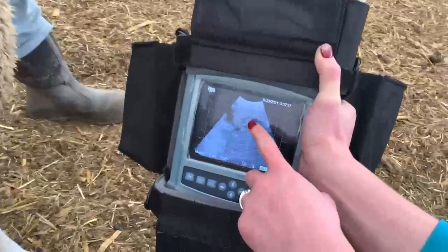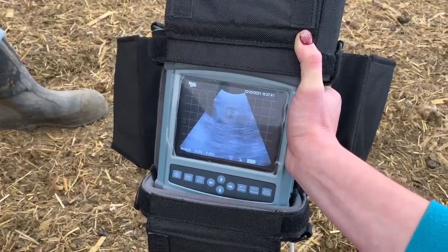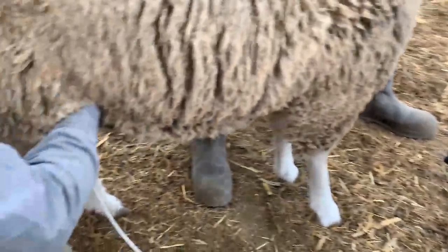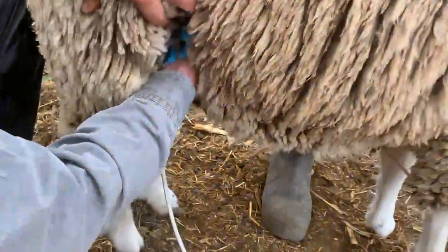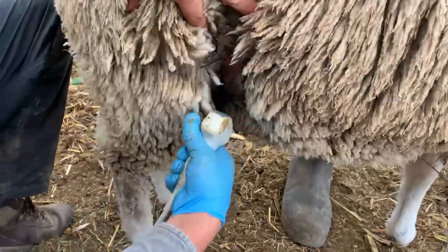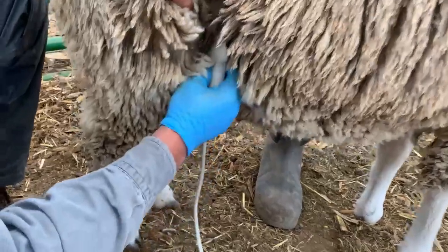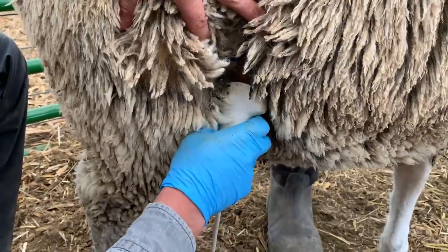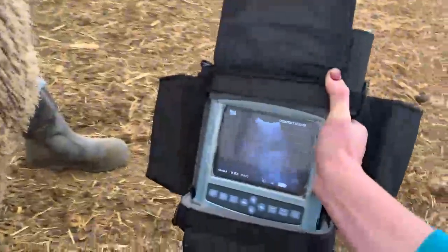You can see the image — we've got a little baby there. Actually, we've got twins in this case. You can kind of catch both of them. I'm gonna pull this out so you can see the angle I was shooting at. I came up into the flank where it fit right in between the leg and the abdomen, and then I rotated and I'm shooting at the opposite hip.